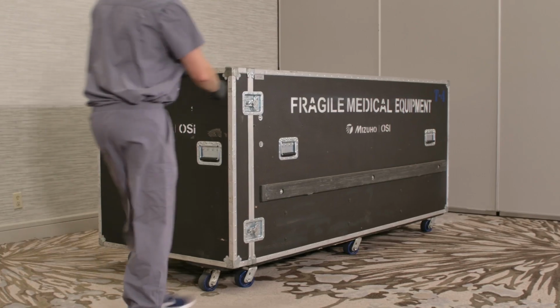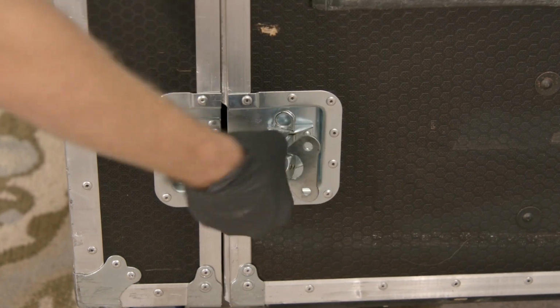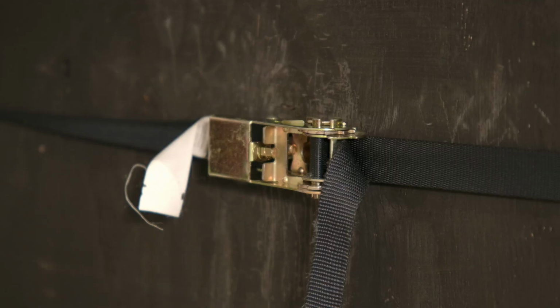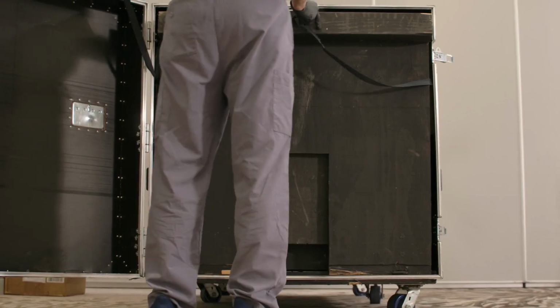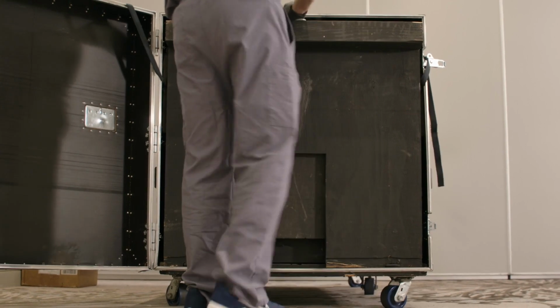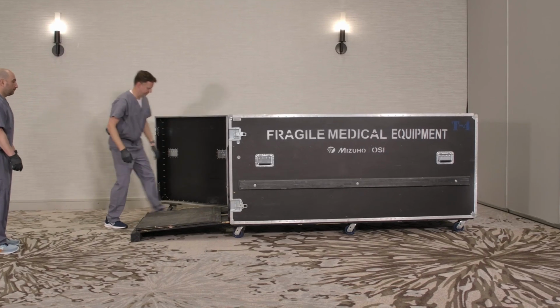On the right side of the crate, unlock the top and bottom latches. Open the crate door. Remove the front strap that holds up the ramp. Place the straps away from the ramp. Lower the ramp to the floor. Then fold open the second part of the ramp.